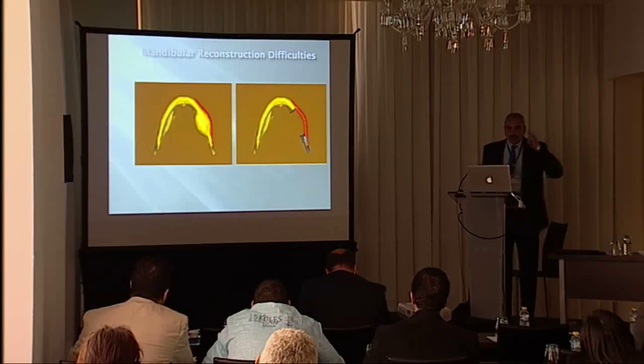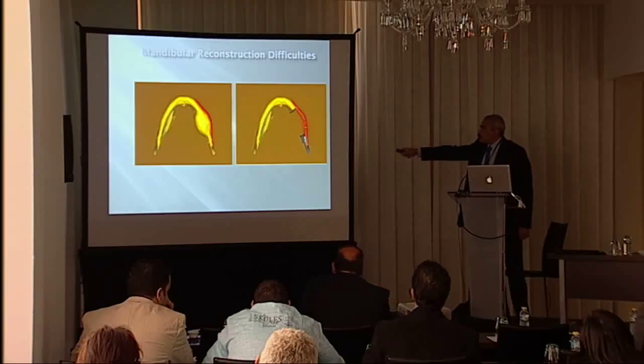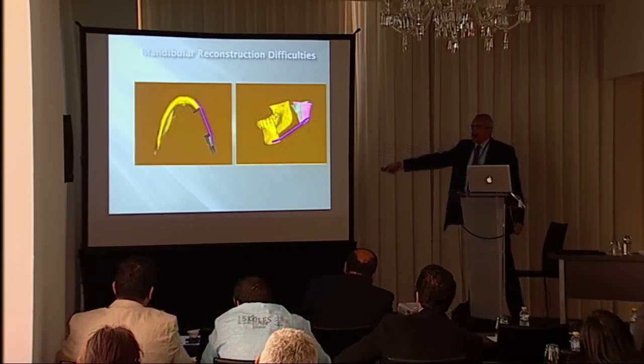We do that to preserve the condylar position. But after doing that, we find out that we contoured the reconstruction plate to an over-contoured position. And that's not what we need. We need to do the proper contouring.